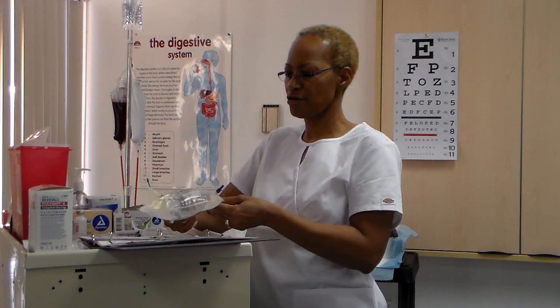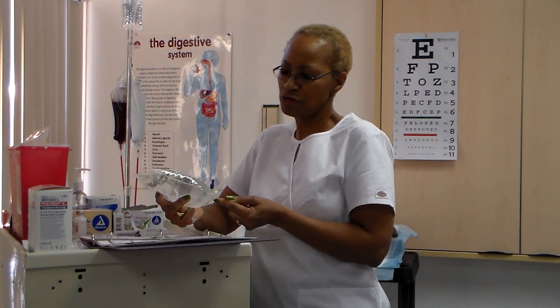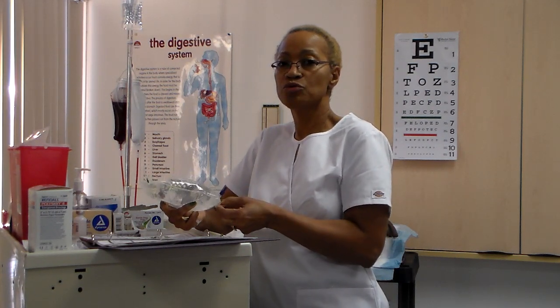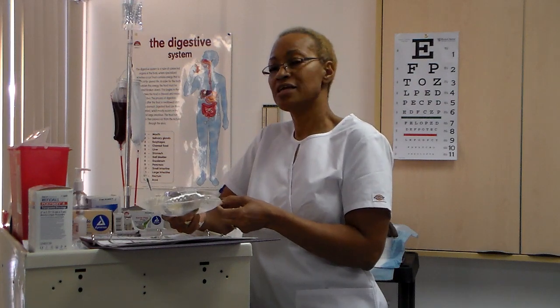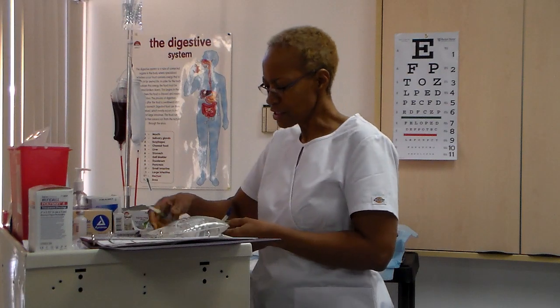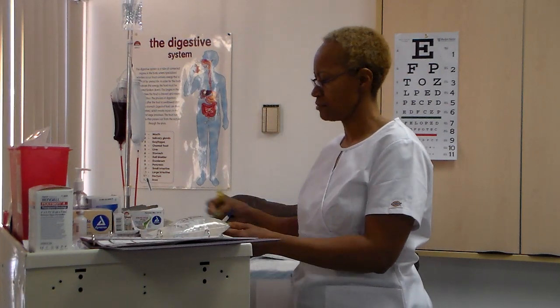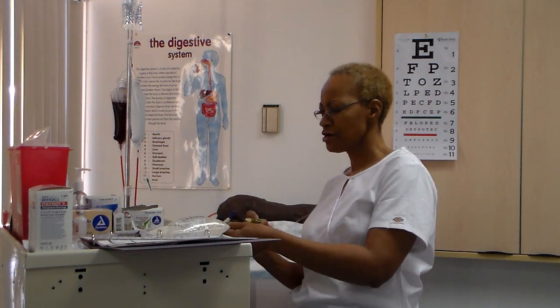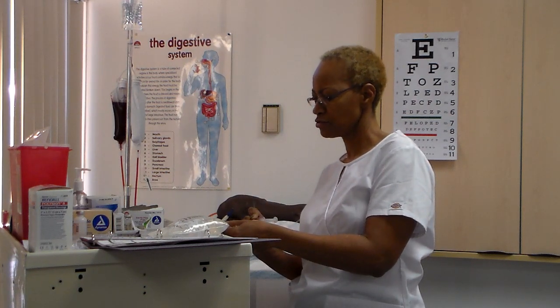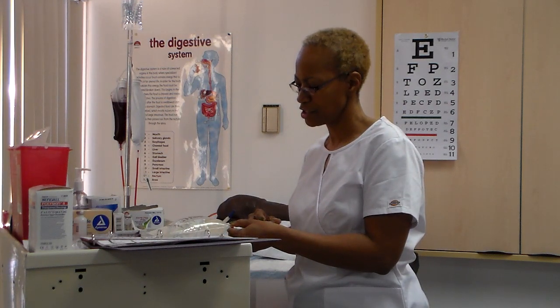Now what's important is you hold your bag, your port even. You don't want to have your port bent, because a lot of times what will happen is if you do that, you may pierce through your bag, and then you've contaminated. You'll have to throw that bag out. So you want to make sure that you have your bag flat and even. In the center of your port again, don't stick yourself, and inject your medication into your bag.